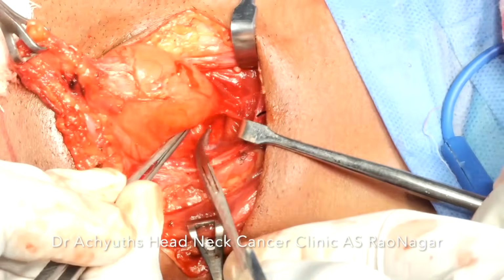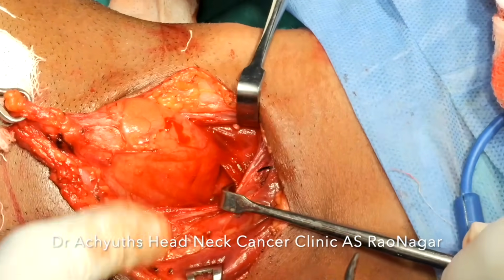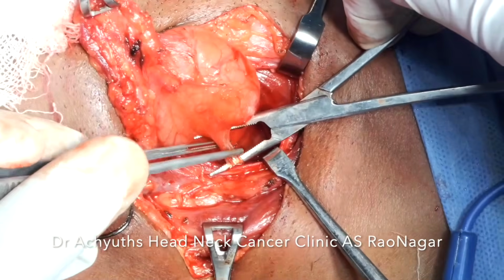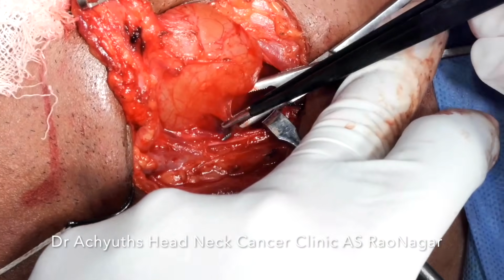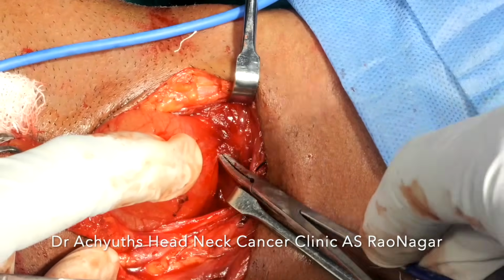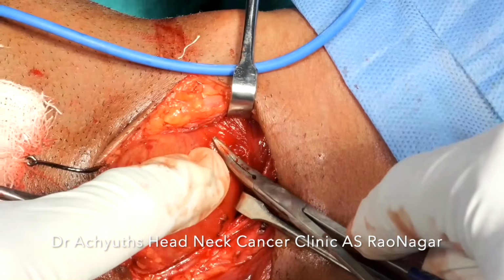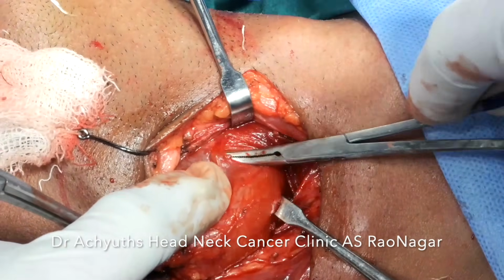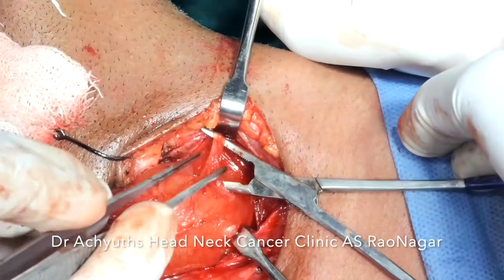Again the muscle attachments. Earlier we divided the muscle attachments from the medial part. Now we have almost come to the inferior part, that is its insinuation into the thyrohyoid membrane, or it is more appropriate to say the laryngocele coming from the thyroid membrane to the external part of the neck, from endolaryngeal to exolaryngeal. So these muscle attachments are also divided. Luckily the adhesions were not very thick and they were easily divided with blunt dissection also.